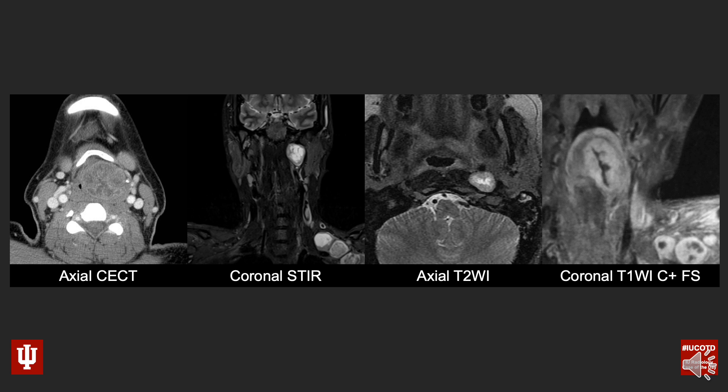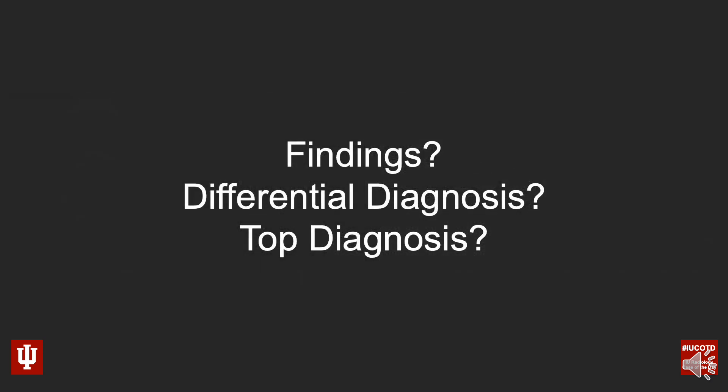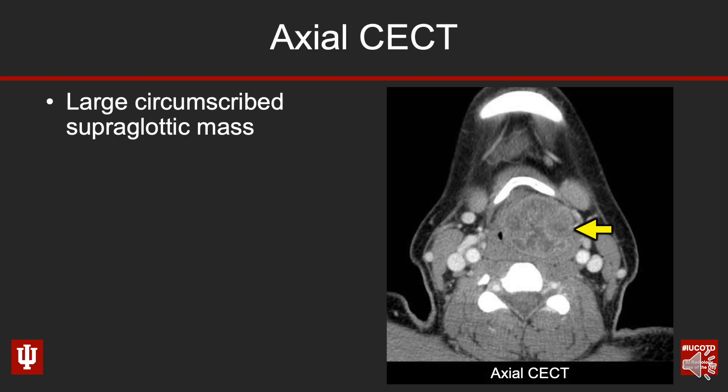Take a look at these images and try to piece together what you think might be happening here. What are the findings? What's your differential diagnosis when you see this kind of pattern, and what's your top diagnosis based upon the clinical information and the imaging findings?